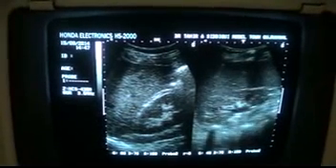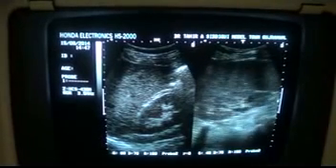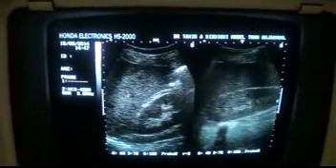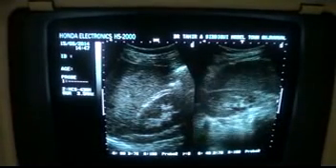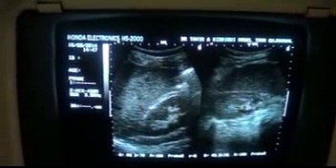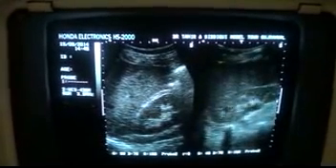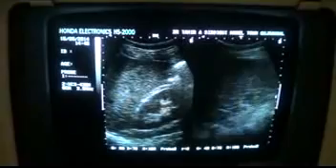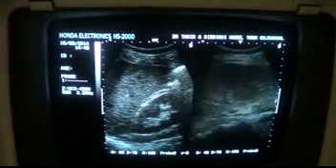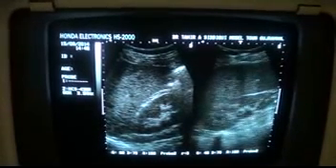Now it's very common to see some cystic areas. Do not consider the cystic areas at times seen in such kidneys. You are seeing the cystic area. This is not a pyramid. This is a cortical cyst. So this is how it goes so far as the renal study is concerned by ultrasound parameters.